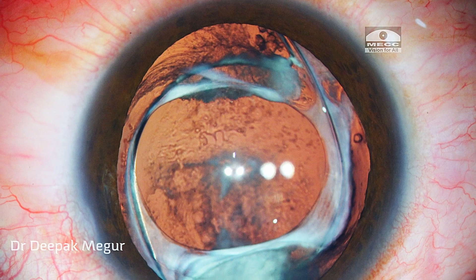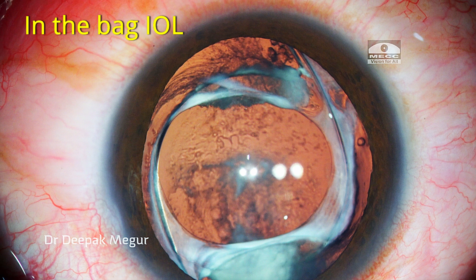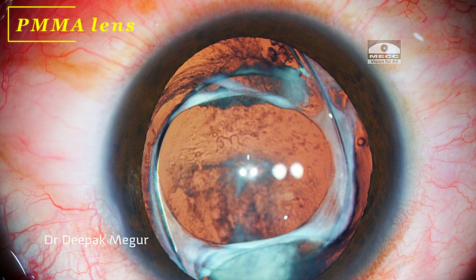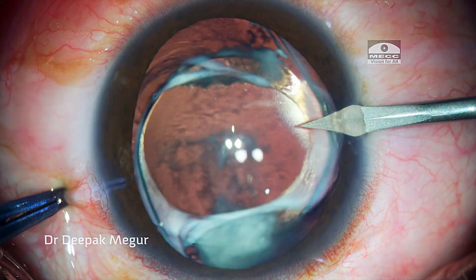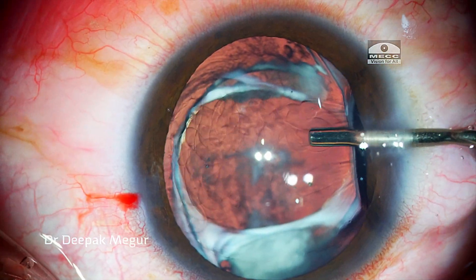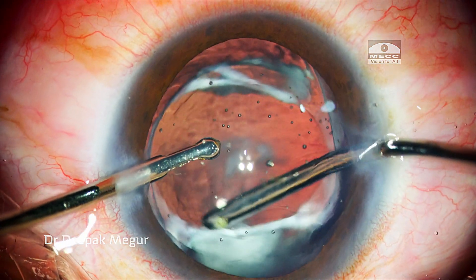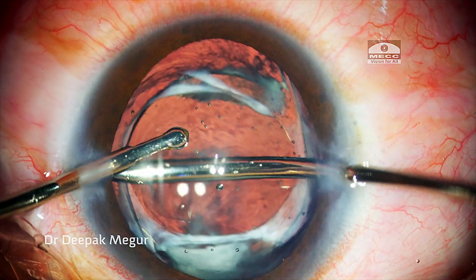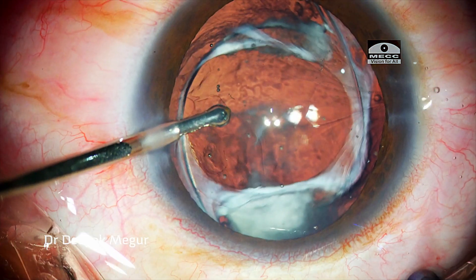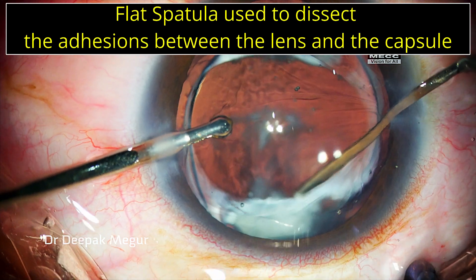As we can see, the intraocular lens is very well placed in the bag and we have a thickened fibrosed anterior capsule covering the optic. Getting access to the posterior aspect of the IOL is going to be tricky. The PMMA surface is not as sticky compared to a hydrophobic acrylic lens, so I'm hoping I can dissect out some space under the anterior capsule. I have just made two side port incisions and introduced the irrigation cannula, trying to separate the space between the rhexis margin and the intraocular lens.